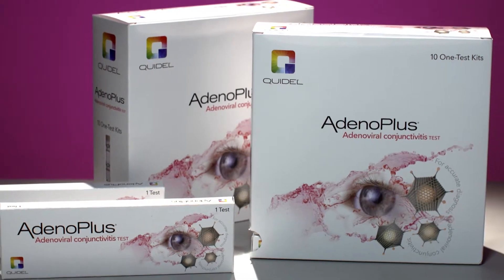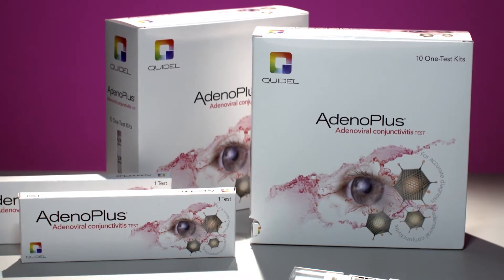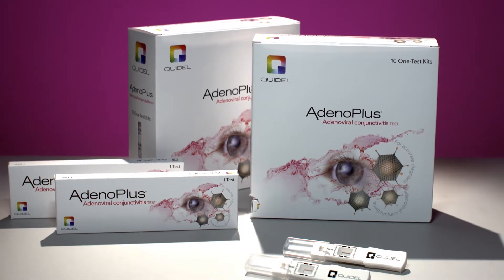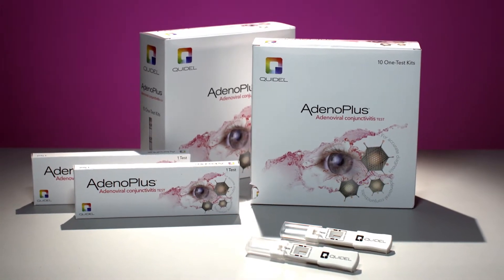Adeno Plus is the first and only rapid, CLIA-waived, point-of-care test that detects all known serotypes of adenoviral conjunctivitis, or pinkeye. Using four simple steps, Adeno Plus test results are achieved in as little as 10 minutes.